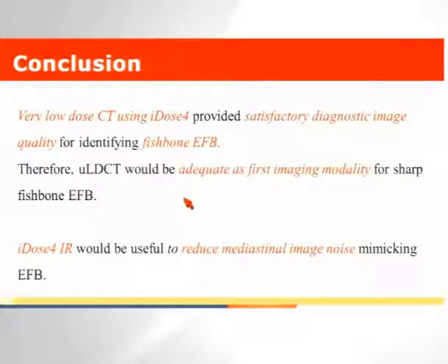Are there any questions from the audience? Just one question. Do you think that if there was a fishbone in the stomach, you would be able to see it with a low-dose technique? Actually, it's very difficult to identify a fishbone in the stomach because there are so many other hyperdense materials in the stomach after a meal.